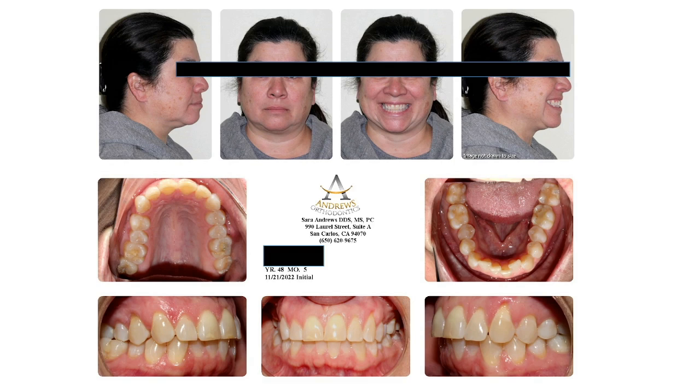But I tell her, I'm going to correct your crowding, but I'm also going to fix your crossbite, so I need you to wear rubber bands. You're going to have attachments on every single tooth. So it's like take it or leave it. I can't pick and choose. The reason I have to correct the crossbite is that I have to address arch form. If you look at that lower right, you're looking at number 30, it's too far buccal. I cannot not straighten that and then straighten everything else. It just doesn't work, unfortunately.